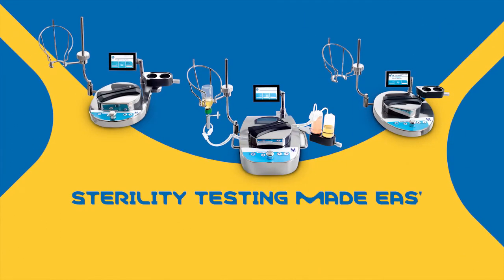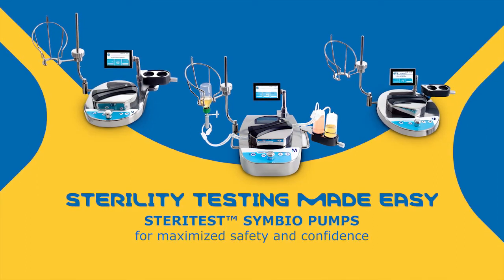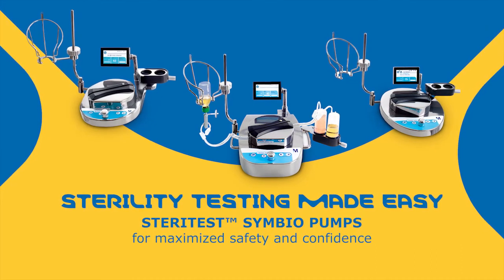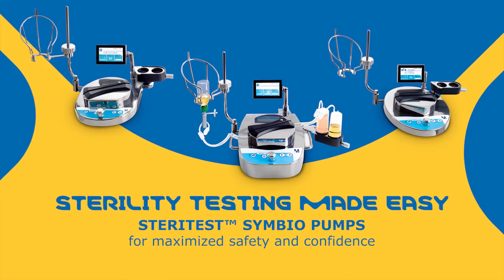All this ensures that the new SteriTest Symbio pumps work perfectly in laminar flow hoods, clean rooms and isolators. New SteriTest Symbio pumps, making sterility testing easier and helping you maximize safety and confidence in your test results.